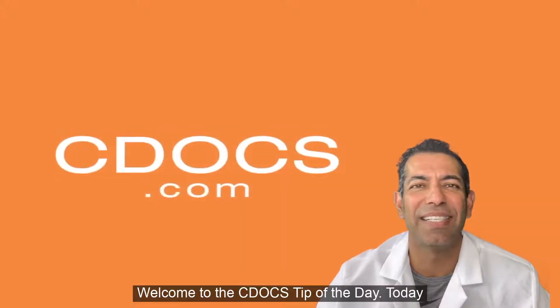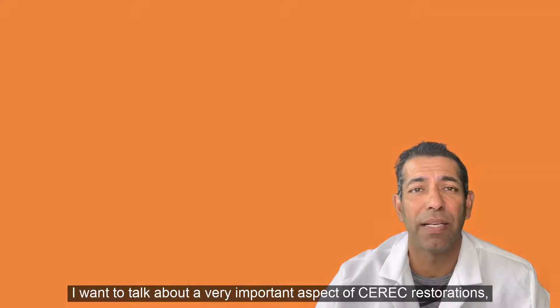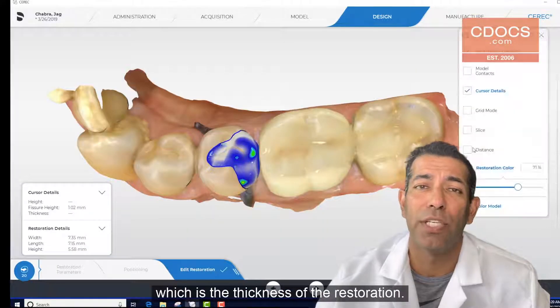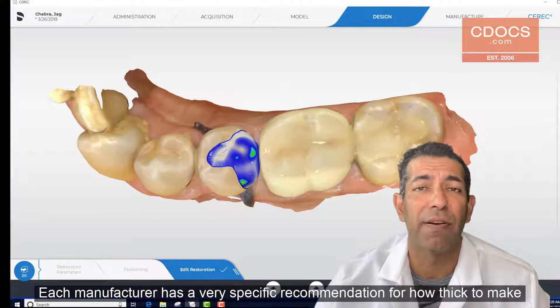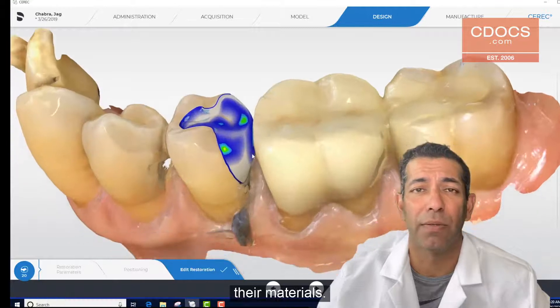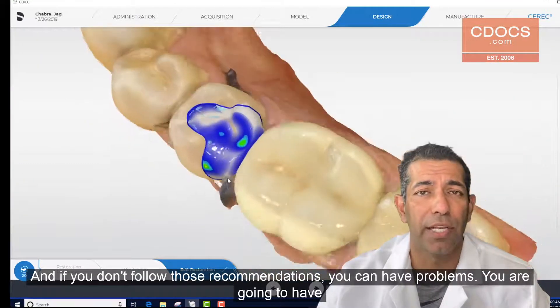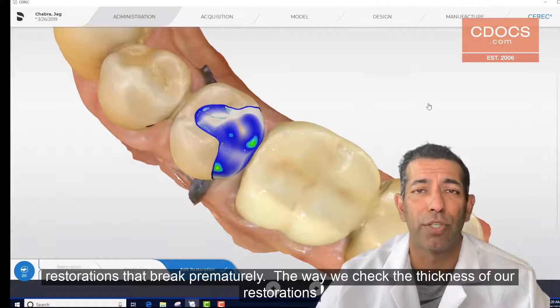Hi, welcome to the C-Docs tip of the day. Today I want to talk about a very important aspect of CEREC restorations, which is the thickness of the restoration. Each manufacturer has a very specific recommendation for how thick to make their material. And if you don't follow those recommendations, you're going to have problems — you're going to have restorations that break prematurely.